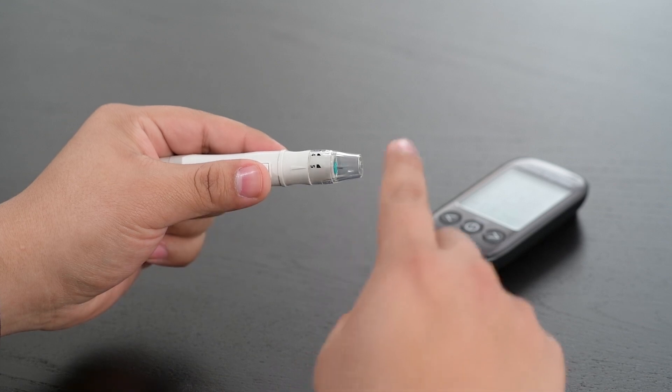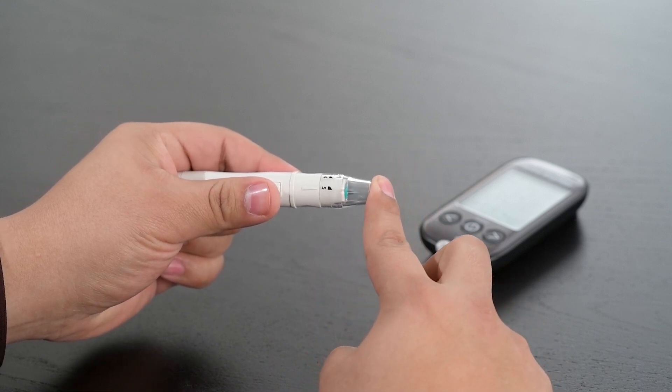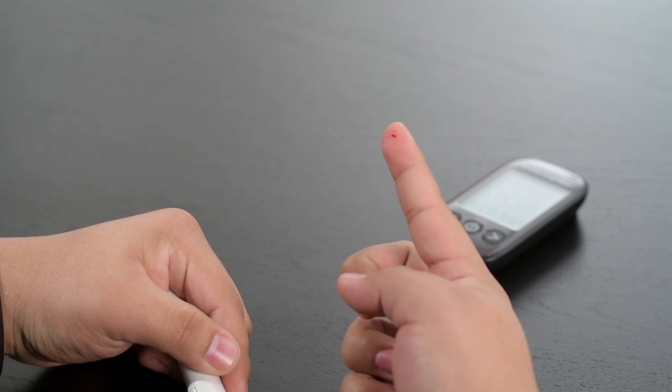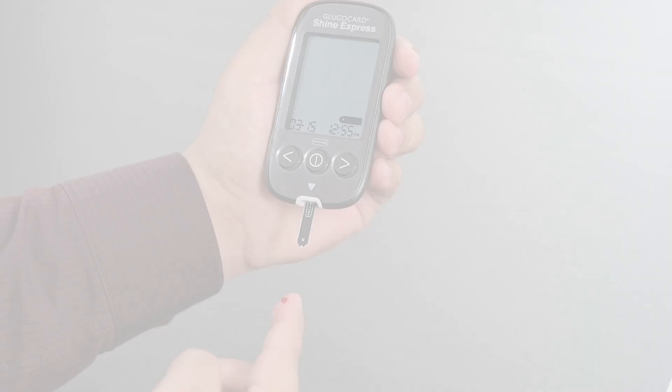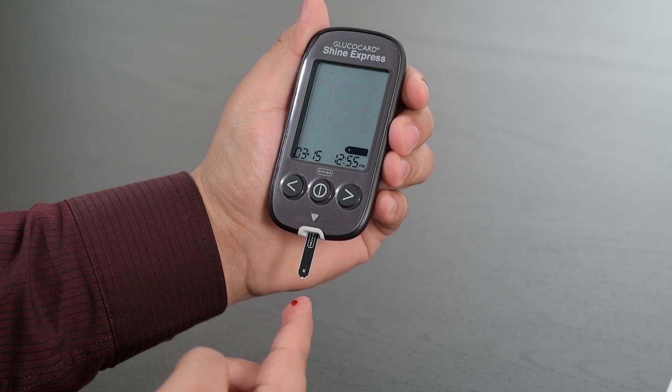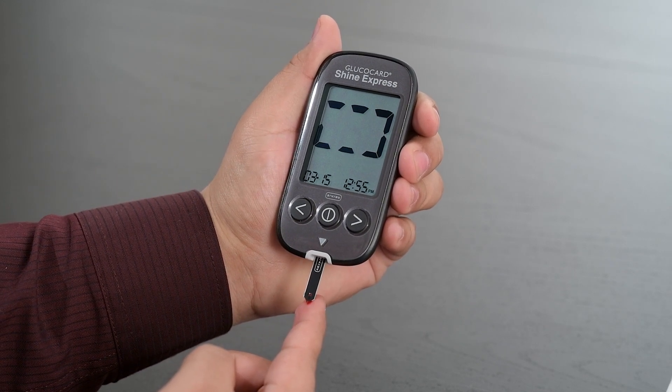Place the lancing device against the side of your finger and press the release button. Wait a few seconds for a blood drop to form, then apply the blood sample to the narrow end of the test strip until the meter beeps or begins to count down.